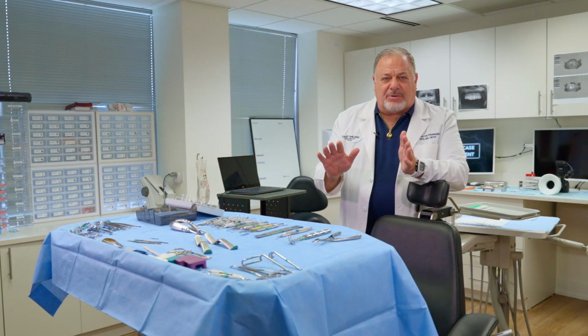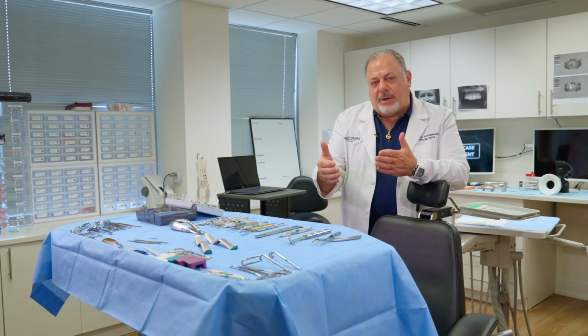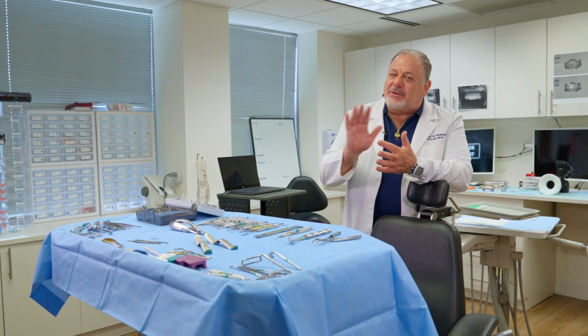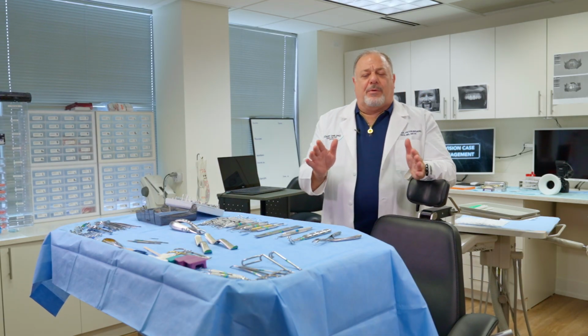Whether it's an all on X, whether it's a single tooth, whether it's multiple teeth, it just is a better setup for me because, when you're taking out titanium implants, you're dealing with compromised tissue quality, health, contours, volumes of it. Well, when you're replacing it now with something that's less inflammatory, that has more propensity to have good soft tissue healing and health with zirconia, that takes away some of the negative aspects of it. So now what we have to be prepared for is just about anything that's going to happen.